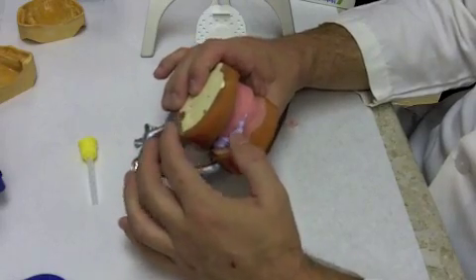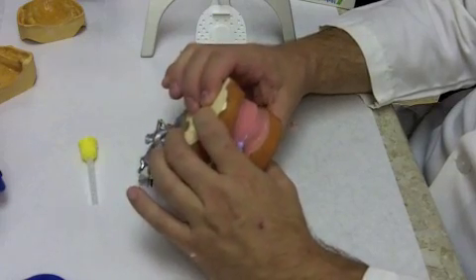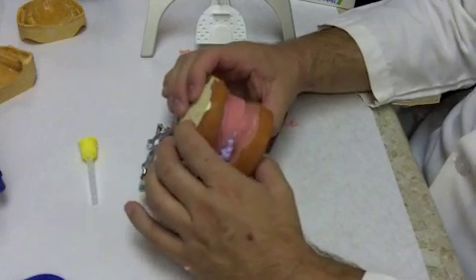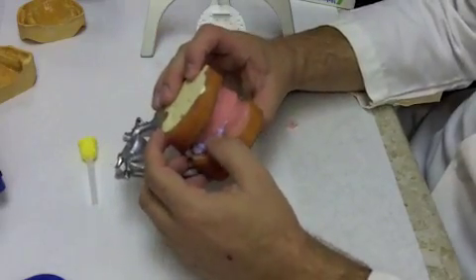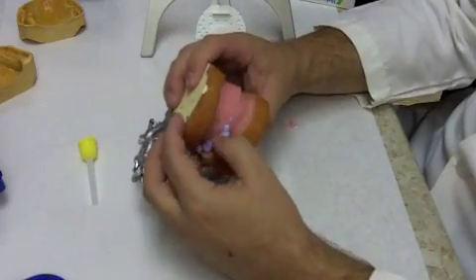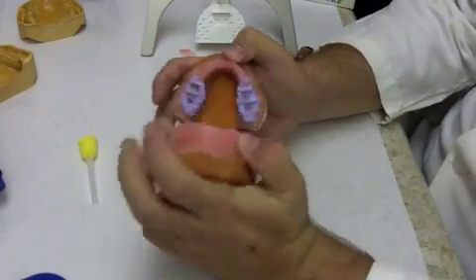And this material, the registration material, usually takes about 45 seconds to a minute to set up. So with a patient on the clinic floor, you want to make sure that they have their tongue again reaching the roof of their mouth as far back as they can, and they want to hold that position. Usually you have to hold the mandibular rim when the patient closes, and you want to hold that position for that 45 seconds to a minute.